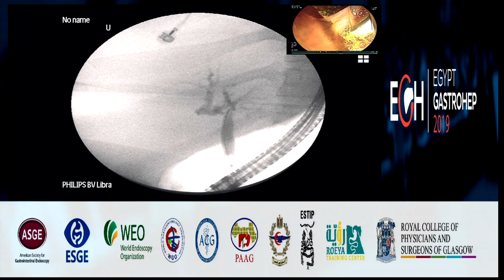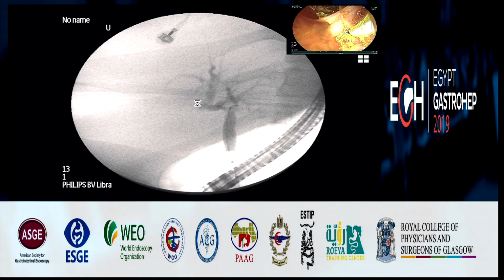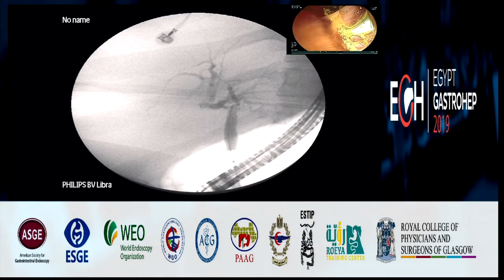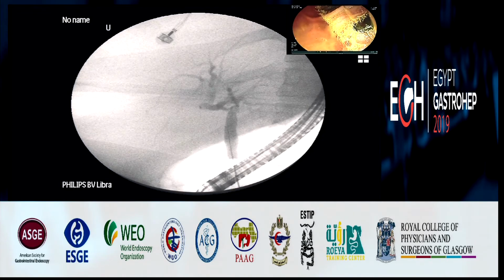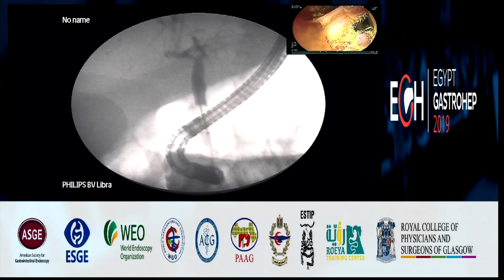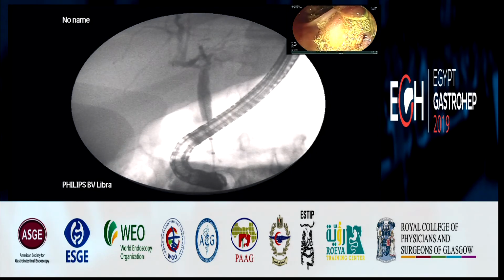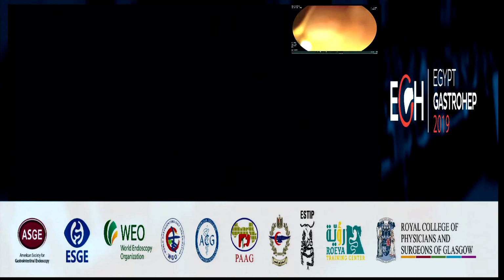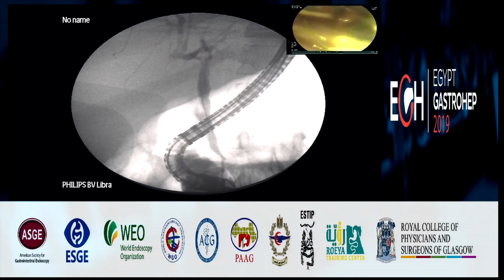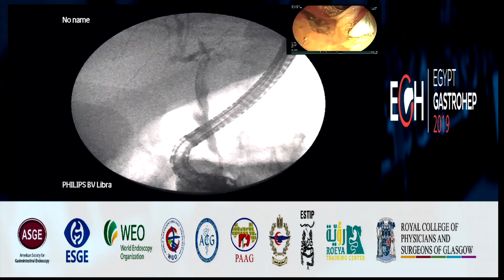So can you follow with the fluoro down towards the... Okay, now I'm fluoro coming down, down, fluoro down, down, and you can push down the wire to keep in place at the same time. So I don't see any residual stones. But what about the balloon left side? And the left side seems a bit irregular. Yeah, here we are out, so you can deflate the balloon.